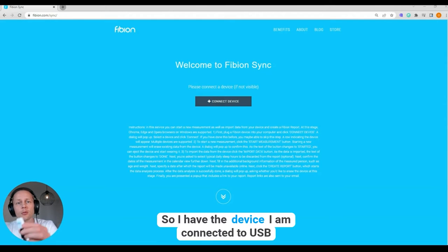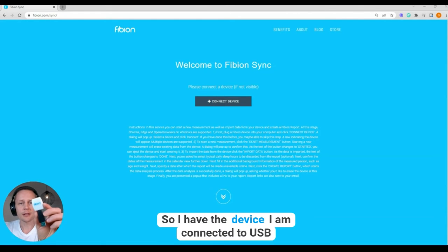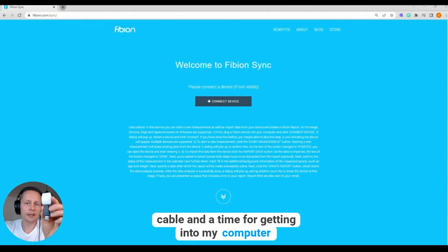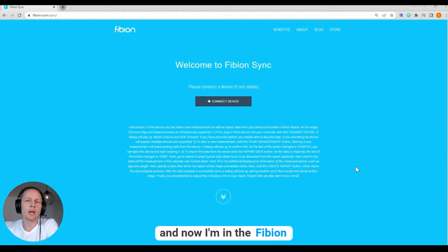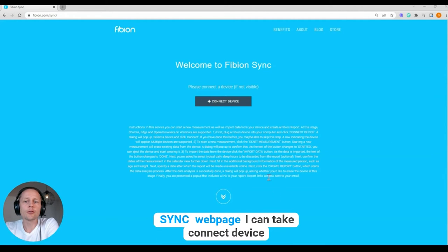So I have the device, I have connected the USB cable, and I plug it into my computer. And now I'm on the Fibion Sync web page.